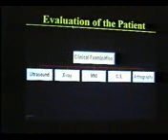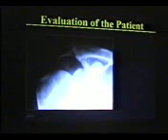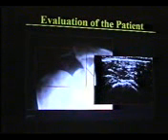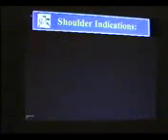For evaluation of the patient, the first thing is clinical examination followed by ultrasound. If we find any pathology of the soft tissues, we don't need any other modality to confirm it. But if there is suspicion that the bones are involved, we can go for X-rays followed by MRI, CT and arthrography. Evaluation of the patient is very important. Here is a patient in which there was no rotator cuff, and this is deltoid adjacent to the bone, so supraspinatus and infraspinatus are not there.